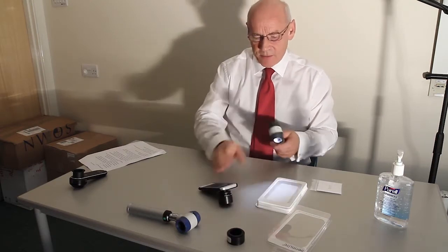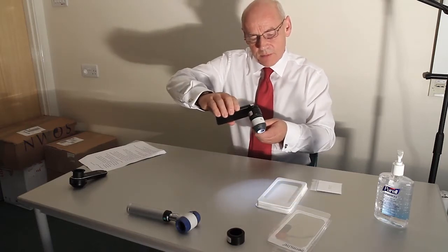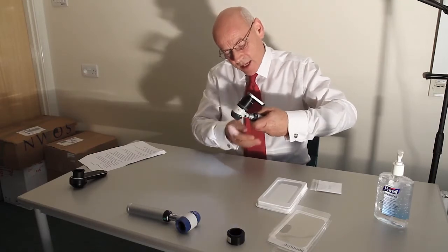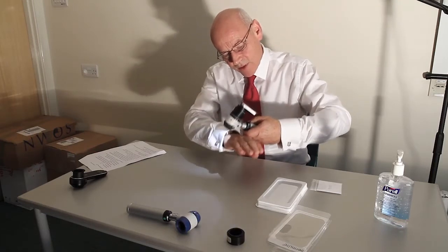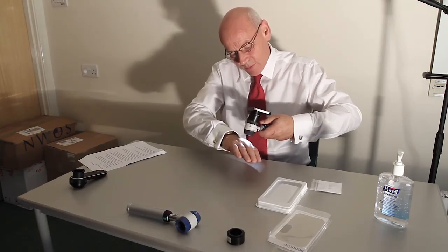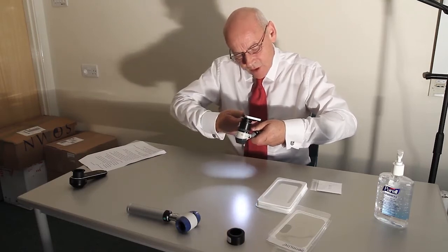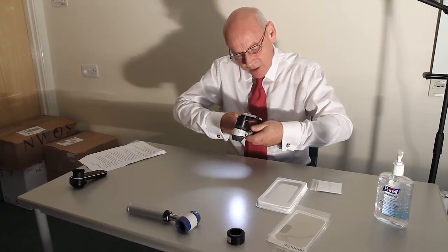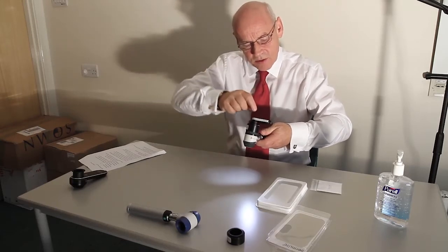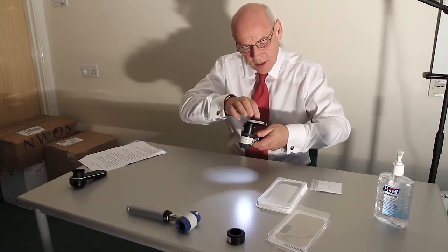And then you turn the dermatoscope on, you put some gel on, you attach this here, you bring it round to about there, and then I like to have my hand in contact with the patient, so if they happen to move, I move nicely with them. So I then bring this here, put this onto the patient, onto the lesion, and then I move this round until I've got the graticules roughly in line with this nice long axis and across the top if you're using the Opticlar. But with the Heine, you just got the long axis this way. Open it out this way, like that.